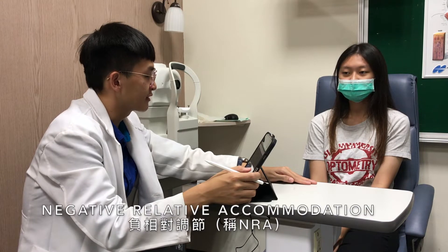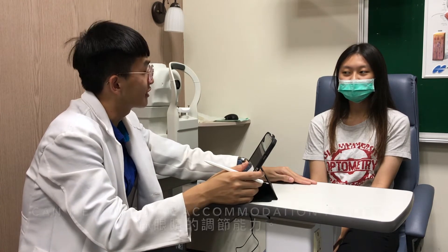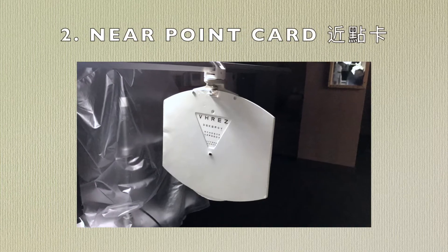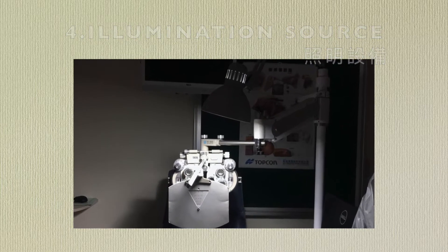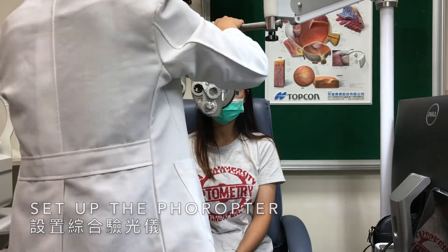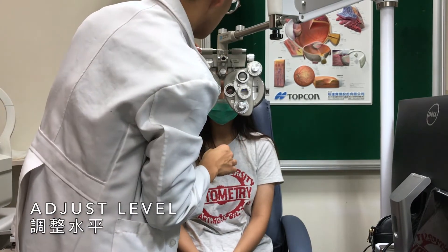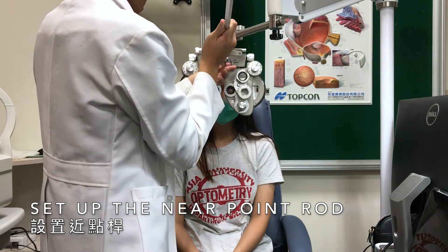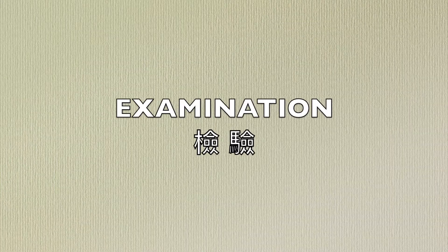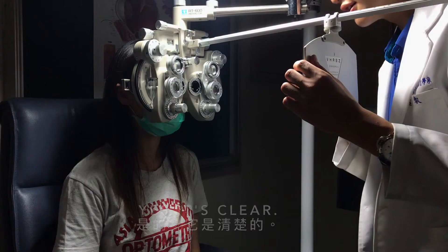Now we are going to do the negative relative accommodation and positive relative accommodation test. It is a test that can measure your accommodation ability. Please tell me if the bottom line of the chart is clear or not. Yes, it is clear.